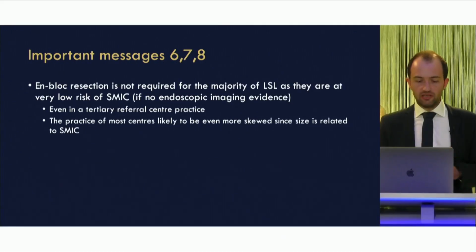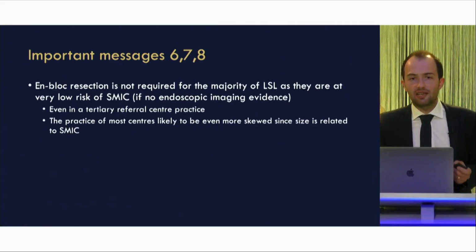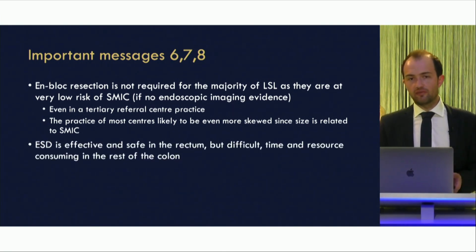So an en-bloc resection is not required for the majority of laterally spreading tumors, as they are at very low risk of submucosal invasive cancer if you can't see endoscopic imaging evidence of it. Even in tertiary center practice, even in the best hospitals at EMR in the world, this is still the case in over 75% of the lesions. So in most cases, in most practice, that's 95% or more.